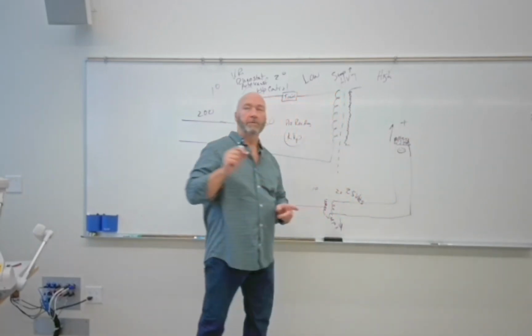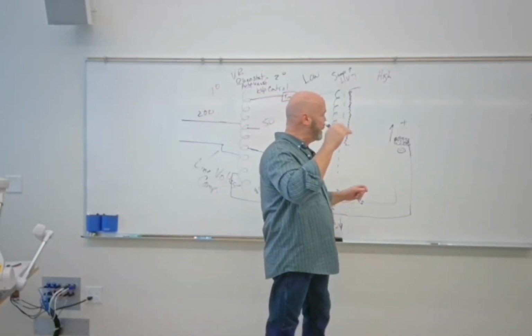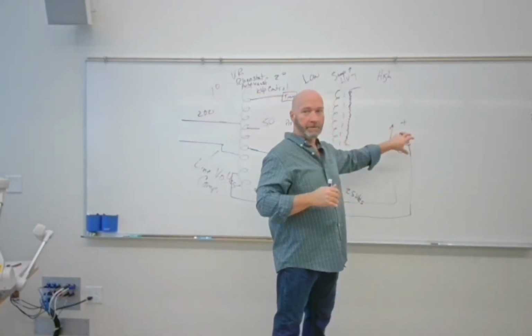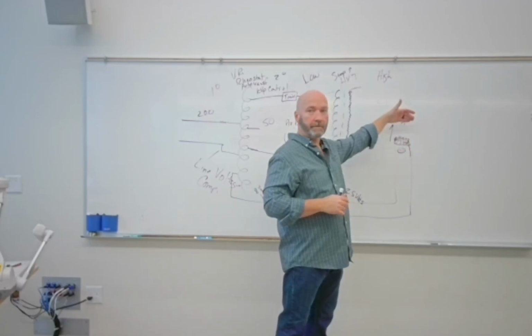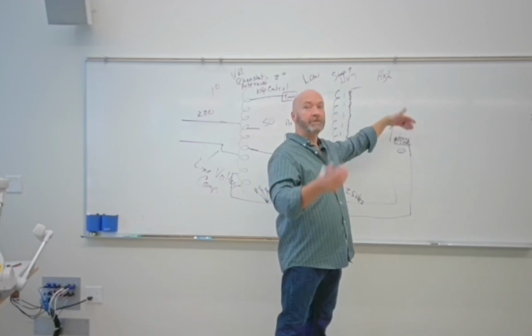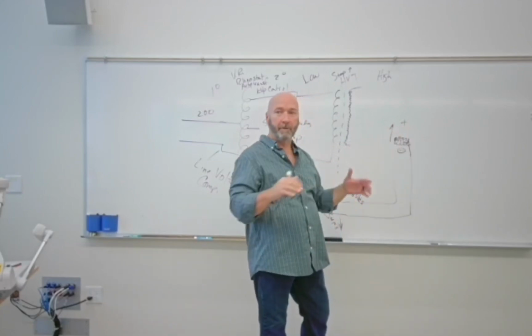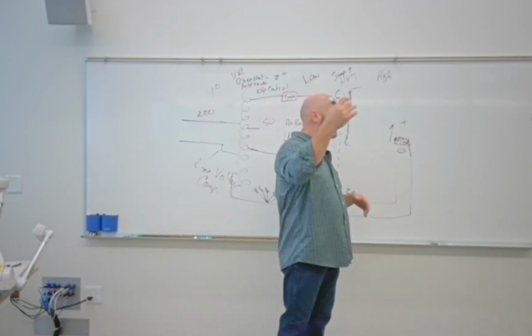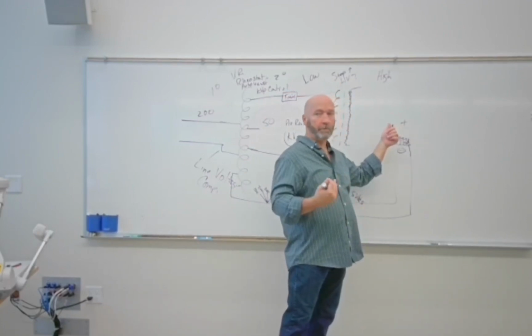But you can get to an exposure that's so high that you can't replenish those electrons fast enough to keep the exposure up. Does that kind of make sense? Okay, that's saturation current. Saturation current basically means tube limit in every possible way. Even if you increase your kVp to shoot those electrons across faster, you're not going to get any more current.